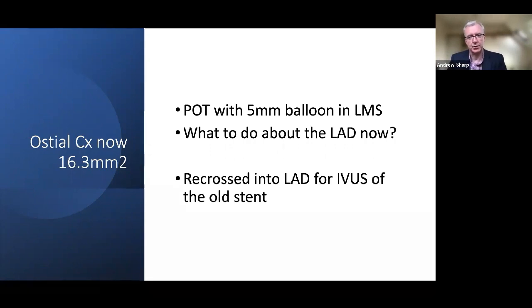So when you're doing IVUS, and this is one of the nice things about co-registration, you can very easily scroll up and down, work out where you're going to balloon from and to, and just have a check that you're not sizing on an inappropriate segment. And you want to be sizing for the distal edge of the balloon. If the distal edge of the balloon is a 4 millimeter diameter segment, don't go above 4.